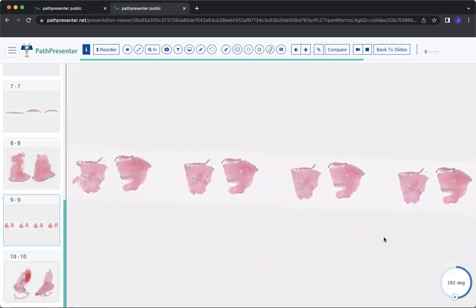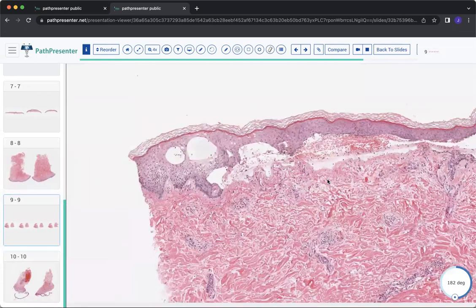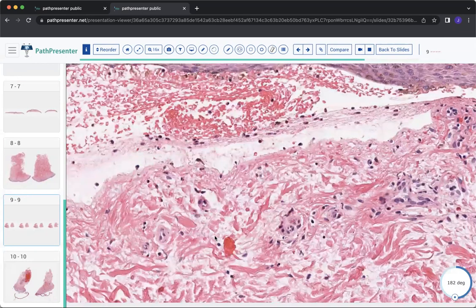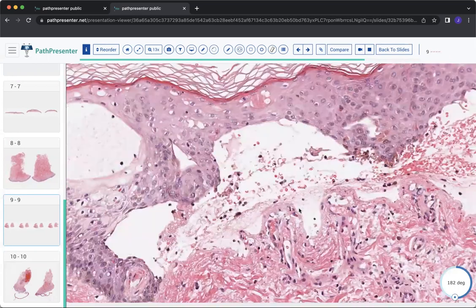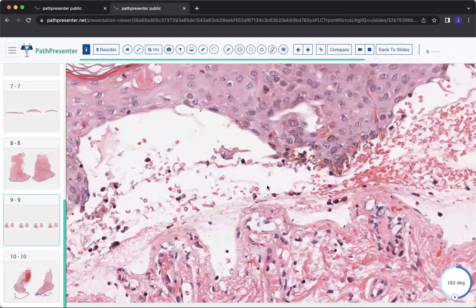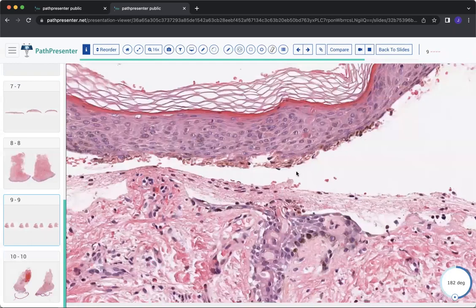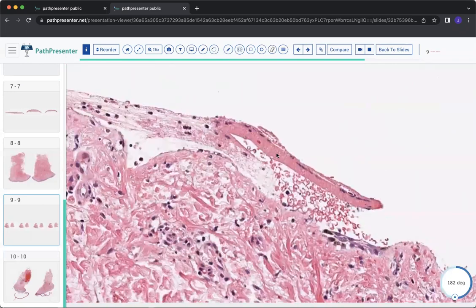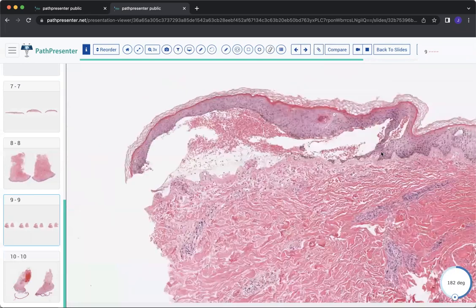Okay, so again, without a lot of clinical information, you can just see a subepidermal bulla on this. If you go on higher power, though, you're not going to see a ton of inflammation here. So you should be thinking of a differential that includes a paucI-inflammatory bulla. You can have a pauci-inflammatory bullous pemphigoid. So you might find occasional eosinophils, so you may not know, is this bullous pemphigoid or is this another entity?